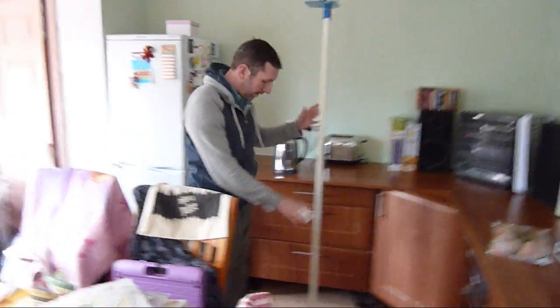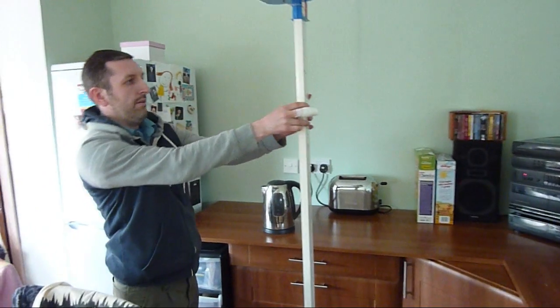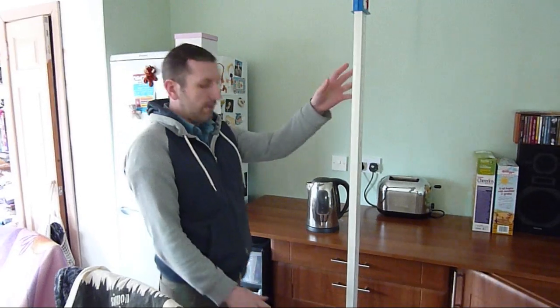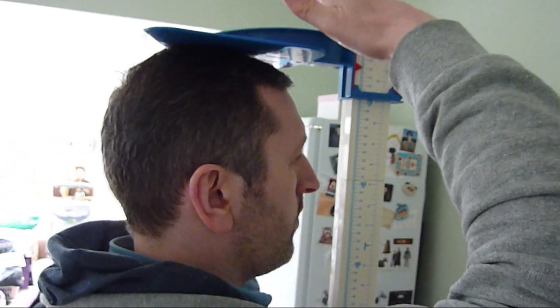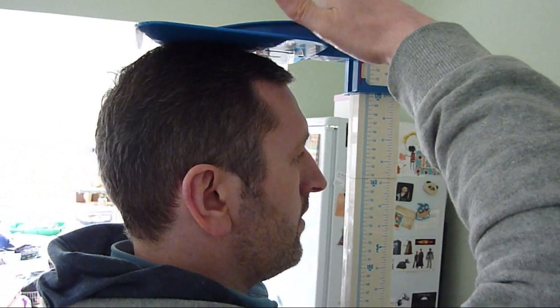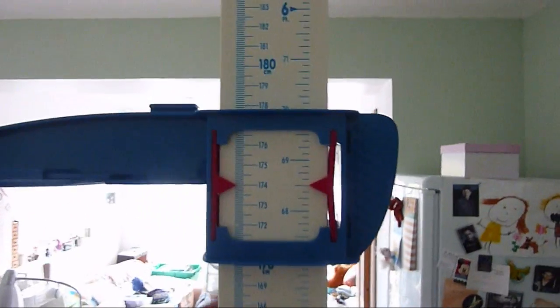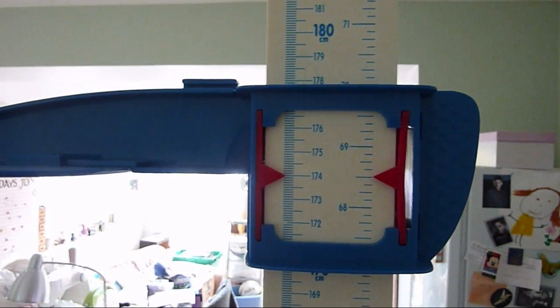So we've got the stadiometer. It's on a level surface and it looks quite straight, so it's not bent either way when we're measuring. The floor's quite straight. Same again — standing tall, looking straight ahead. Bring it down slowly so you can feel it touching the top of your head, and then just tap it down. And we'll find out that we are 174 on the nose.